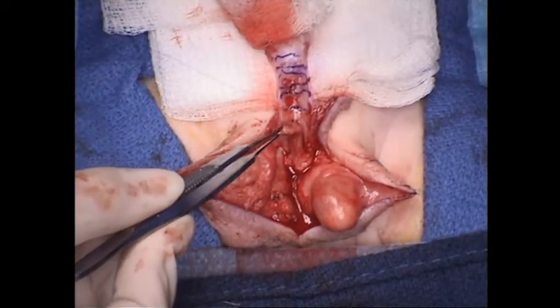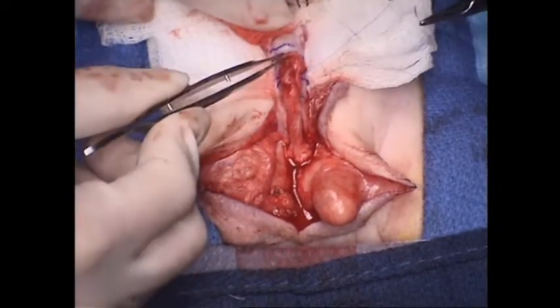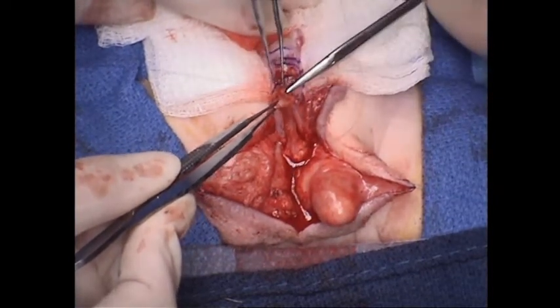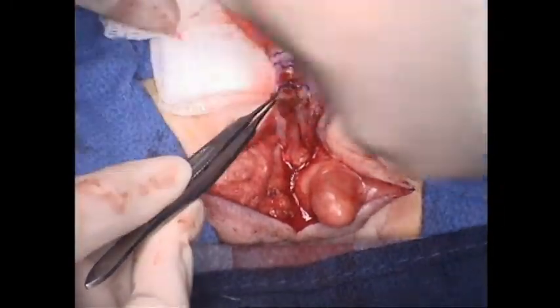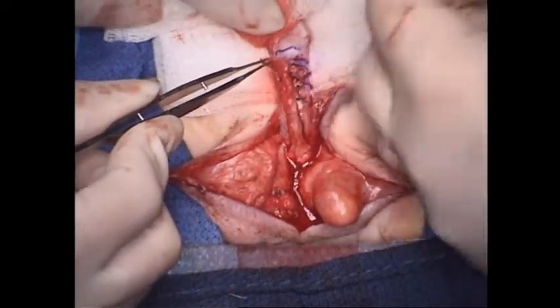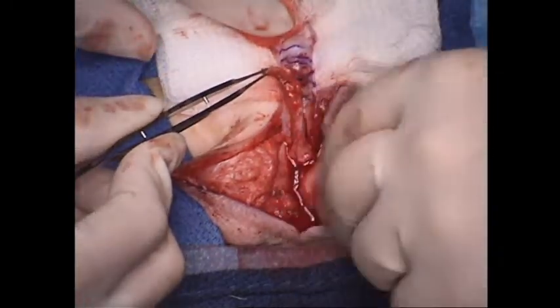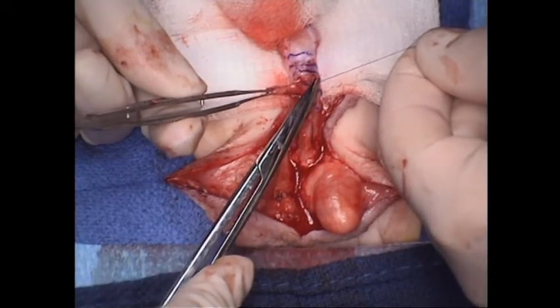How many you cover, of course, depends on where your native meatus was, where the bending is, etc. The more distal the bending is, it's often hard to cover all three of the corporotomies and leave a sufficient amount of space for the graft, as we mentioned. But if he'd had a lower bending, we easily could have covered all three of these corporotomies. And that's where it's nice to have an Asian penis where you didn't have to do the corporotomies at all, but that is not our Latin lot in life.